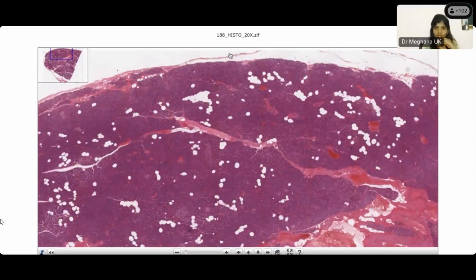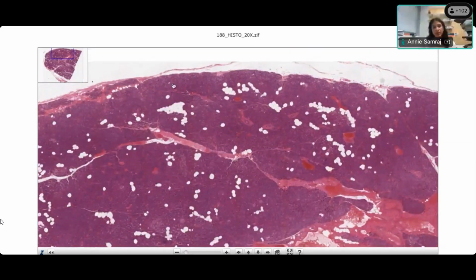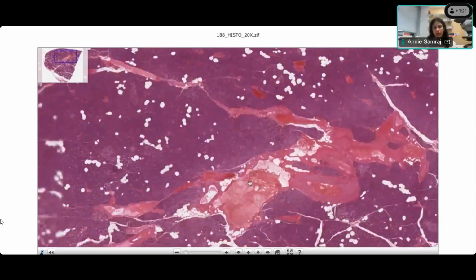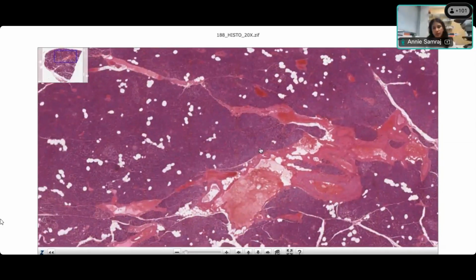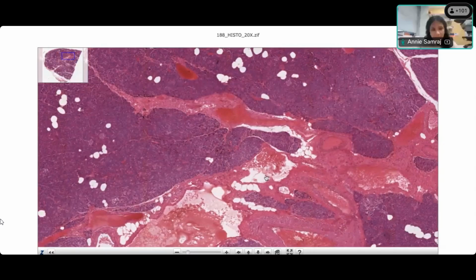And so here you can see this connective tissue. We have these septa coming from the connective tissue, and that separates it into lobules. Now the lobules, sometimes they're not quite complete. Like here, this whole thing is sort of a lobule, but you also have an incomplete septa coming in right here. So what do we have in these connective tissue septa? Blood vessels. Yes, exactly.